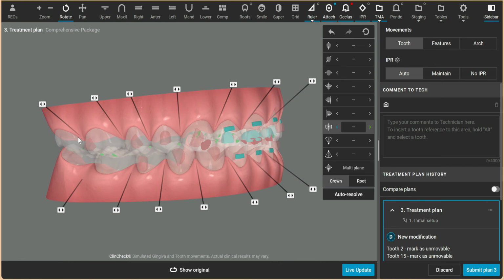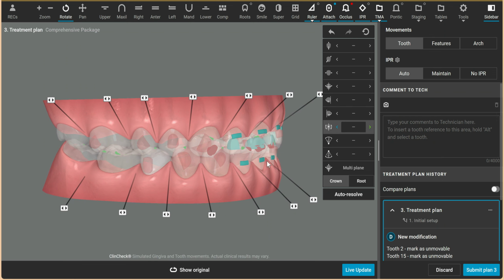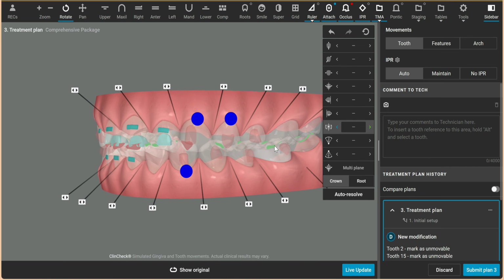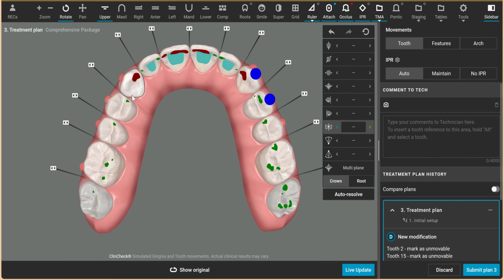So in this treatment plan, there was shifting of the posterior teeth, the second molars and all the teeth mesial to that, which was resulting in no premature contacts in the anterior. Once you remove it, because those movements are not predictable, you're going to end up with premature contacts. So how would you treat this case? Well, right away, because all I did is cancel the movement of the second molars, I know that this case is going to require some relief in the anterior.